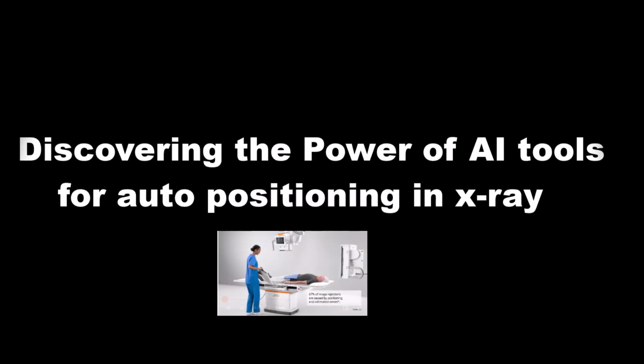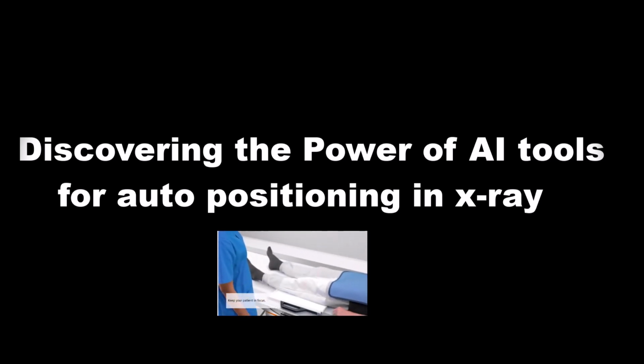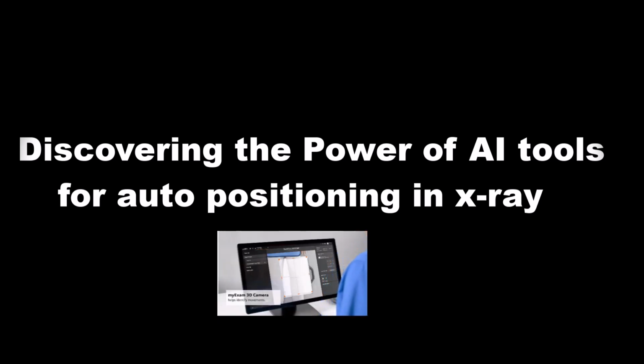Positioning and collimation errors are the most common reasons for image rejections. But unnecessary retakes can be avoided by keeping your patient in focus, even when you're outside the room. My Exam 3D camera helps you to identify movements.